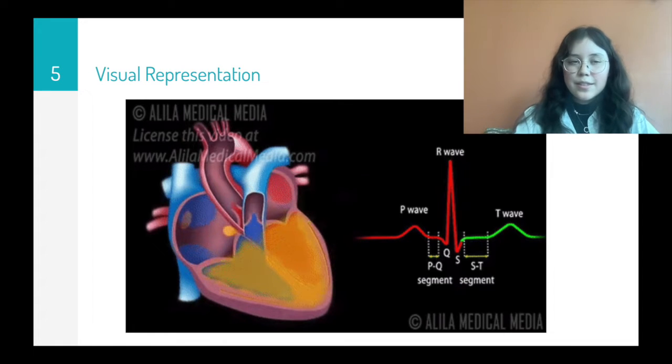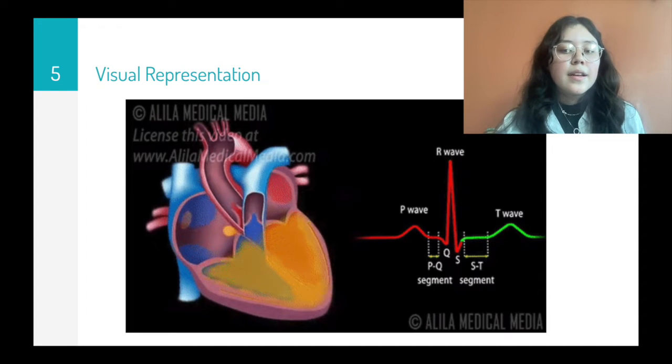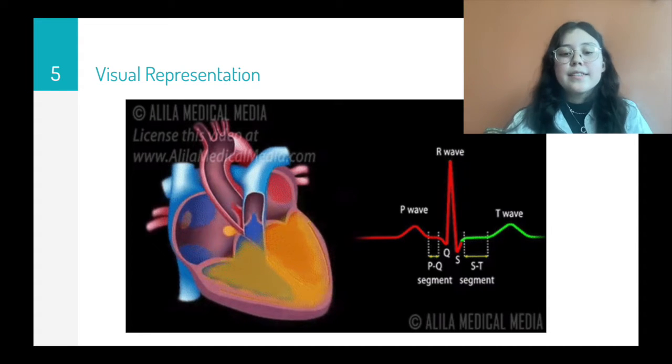If you follow the system, you can see how it flows. And on the right, I provided a PQRST wave, which we will get into next.